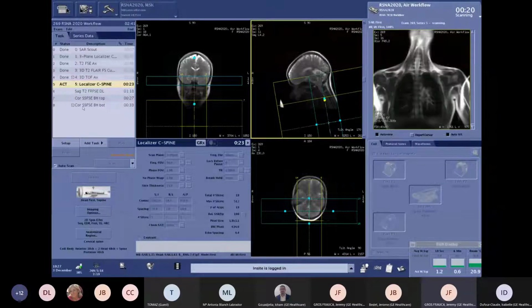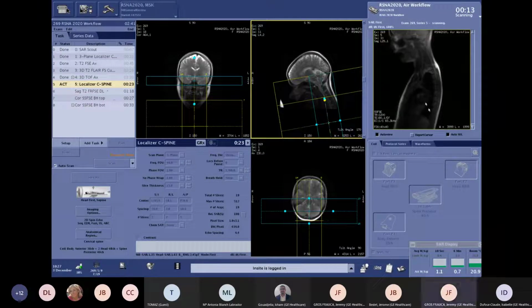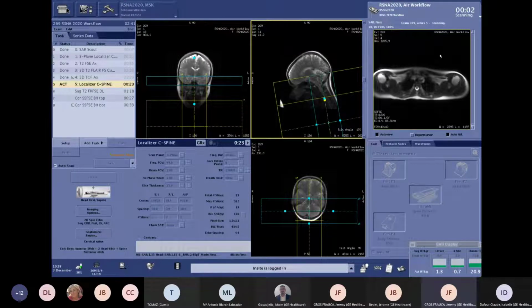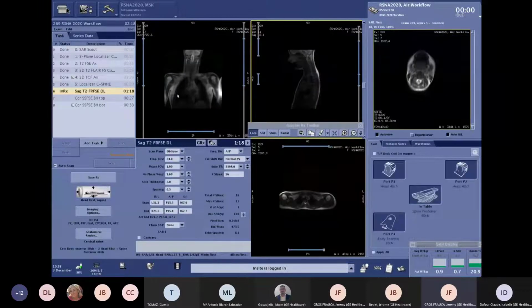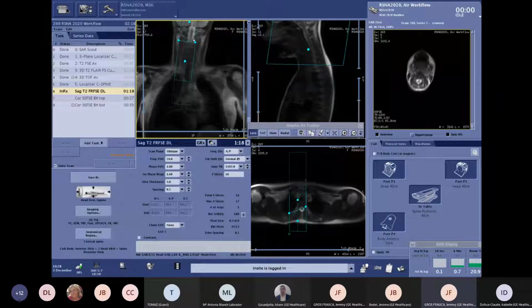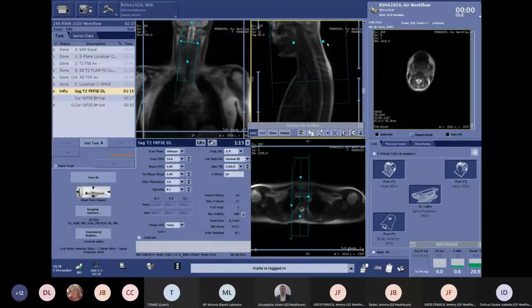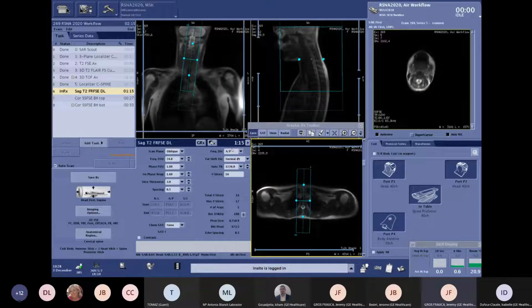And then we will do a quite fast thorax, abdomen, and pelvis to show you the coverage of the Air coil. So you see, I just move my field of view down, and the system switches off the non-relevant elements and switches on the ones that you will need to provide good image quality for this localizer. And it will do the same for the slice prescription for cervical. Let me just position it quickly. Okay, so 1 minute 15, 0.7 by 0.9, 3 millimeter slice thickness.